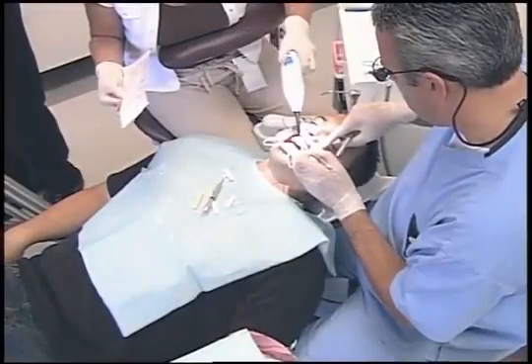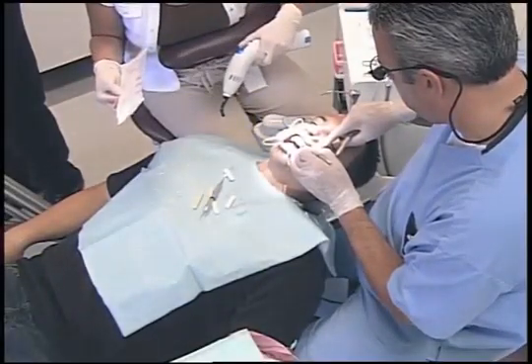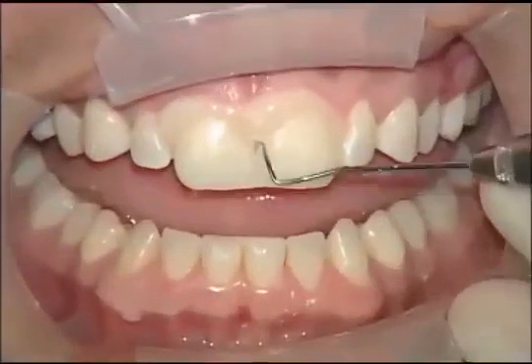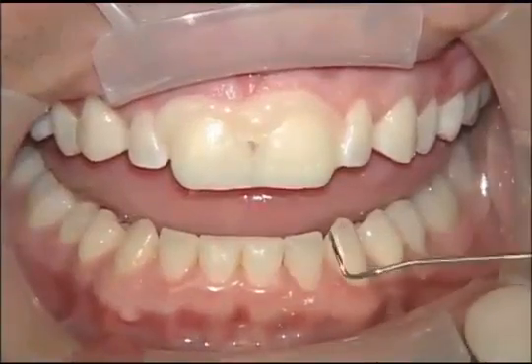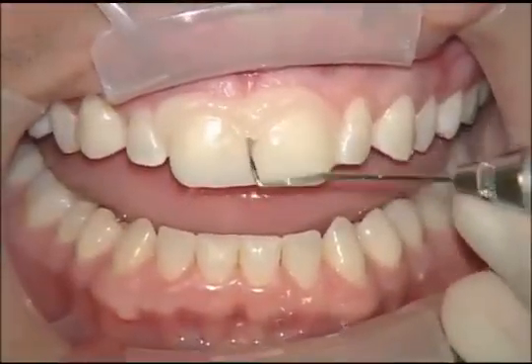So as I put some pressure on these teeth just to make sure they're down all the way, my assistant's going to do a little tack and wave, which is a cure right over, just as you see, 2 passes there at a couple seconds each. And then I go ahead and judge the viscosity of the cement, and if it's still not set all the way, she'll come back in for another 1.5, 2 second cure.